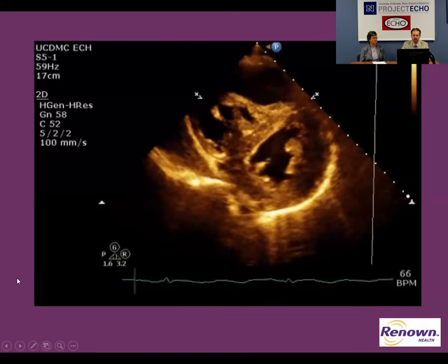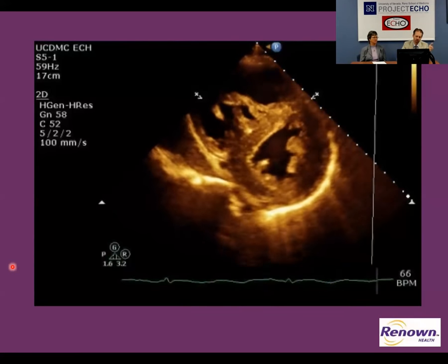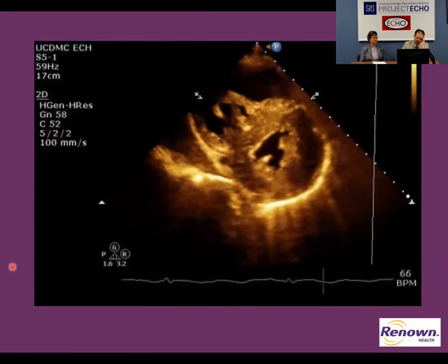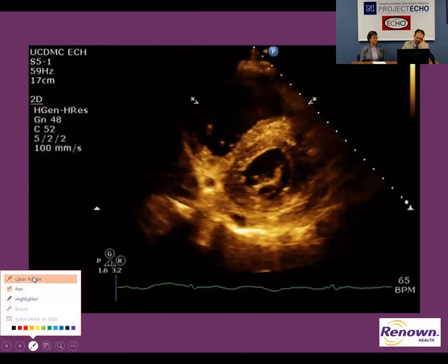Okay, and then you kind of will go up and down the left ventricle at various segments, more apically and towards the apex and back towards the base to see the wall motion in various segments of that chamber. Same thing.